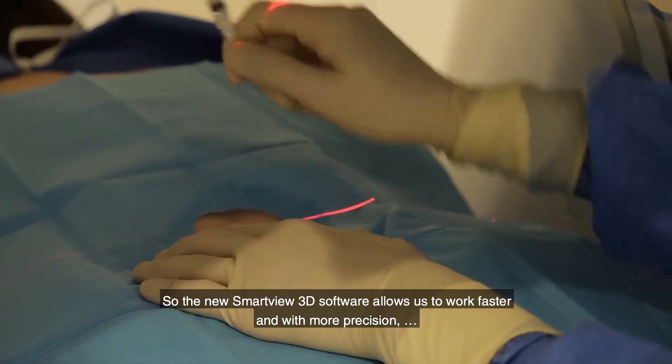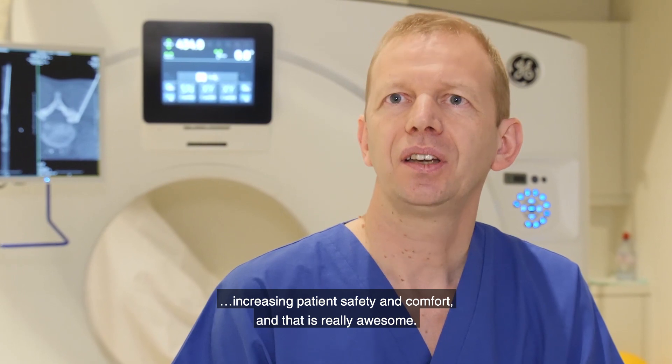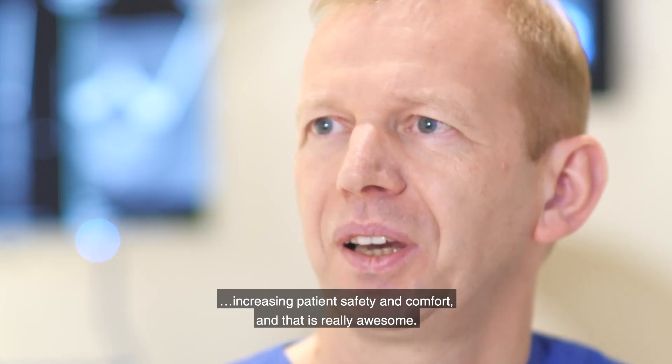The new SmartView 3D software allows us to work faster and with more precision, increasing patient safety and comfort. And that's really awesome.